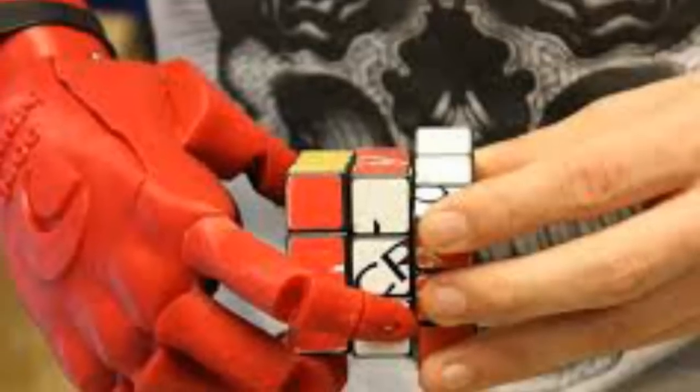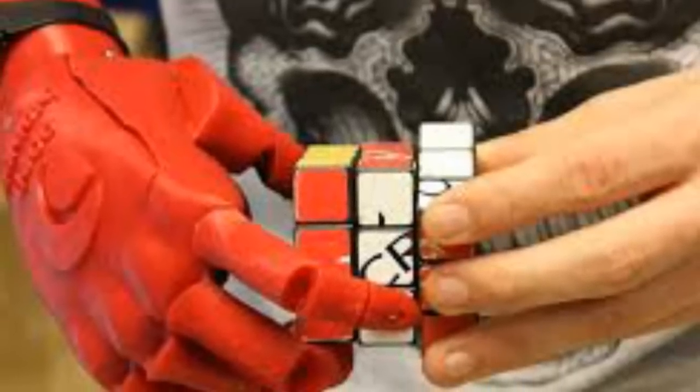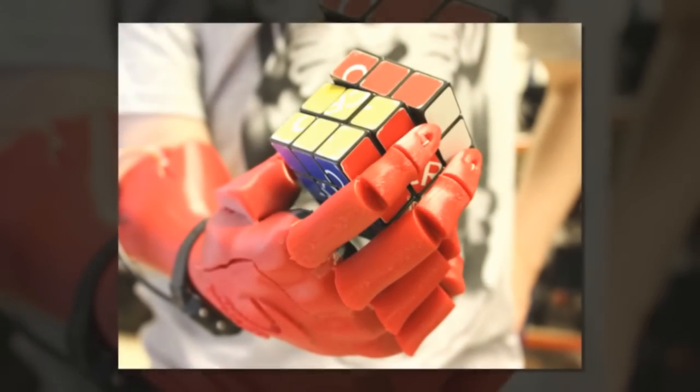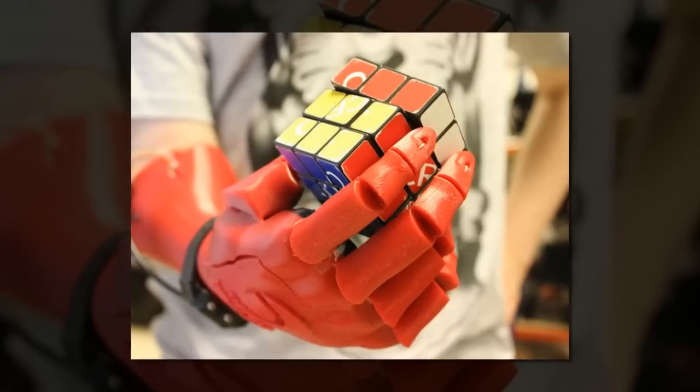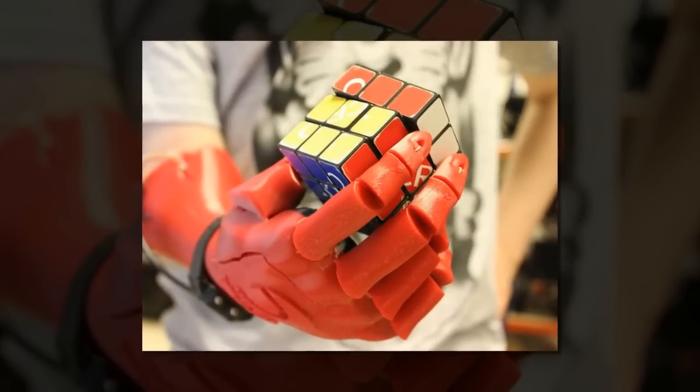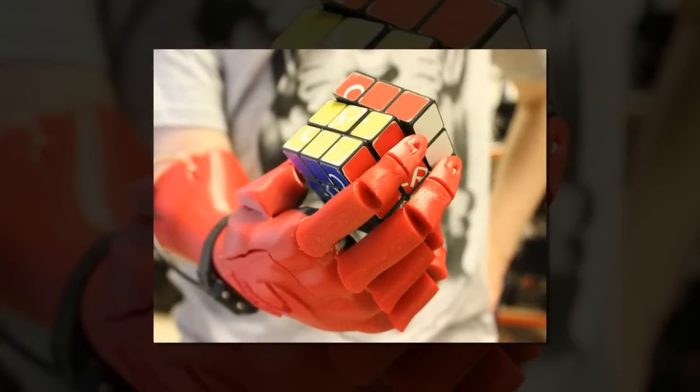Compared to other 3D printed prosthetics available, the dexterous hand has been designed to look much more like a human hand, with smoothed and rounded contours, and design elements such as knuckles.